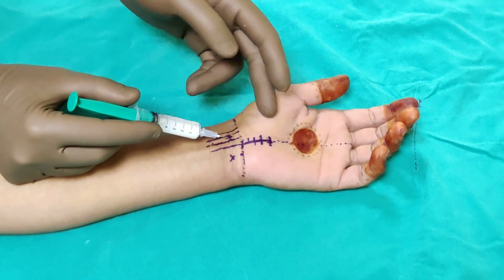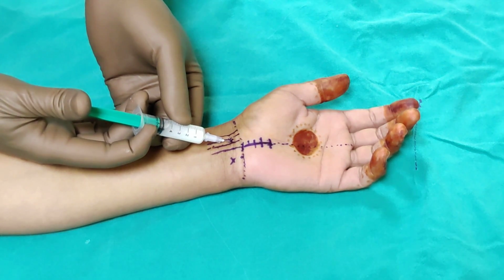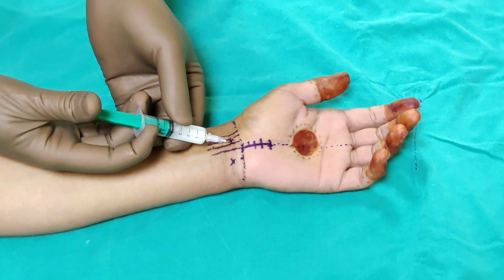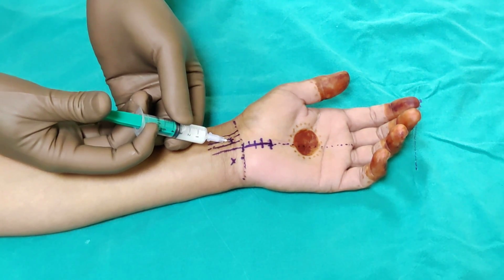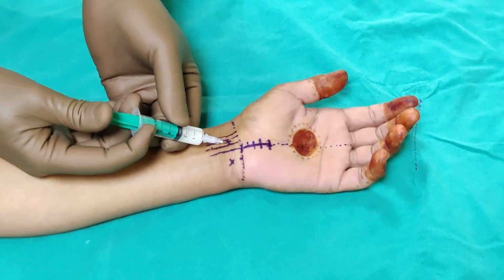Now I am quite radial to it, so I'm just going to inject slowly, just aspirate and then go slowly, and you will not find much resistance. It is slightly uncomfortable for the patient, but if you go slowly, it's usually not that painful.